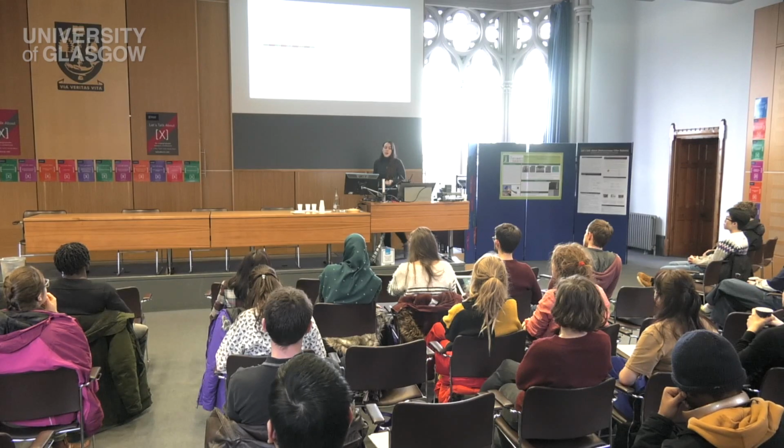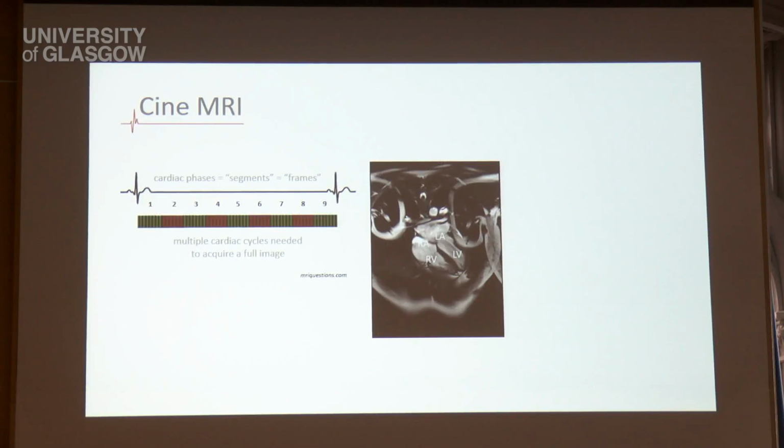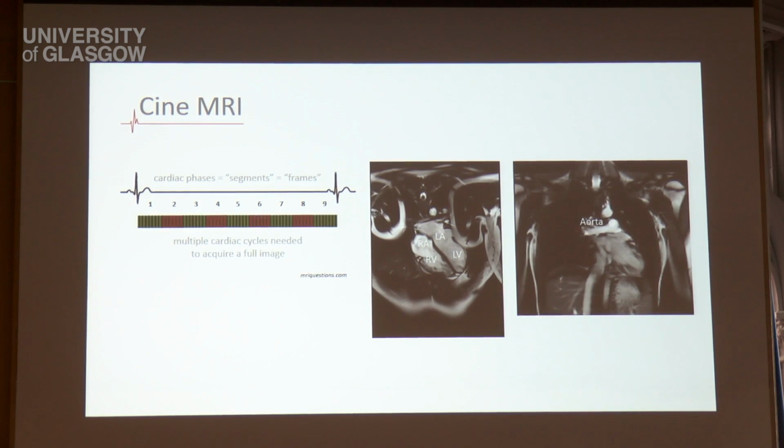The clinical threshold is about 20 to 25 seconds. But this is challenging for even a normal healthy person, let alone if you're elderly or severely ill. But consequently, we get really high quality images of different views of the cardiac anatomy, such as 4 chambers and the vessels that extend throughout the body. And breathe.